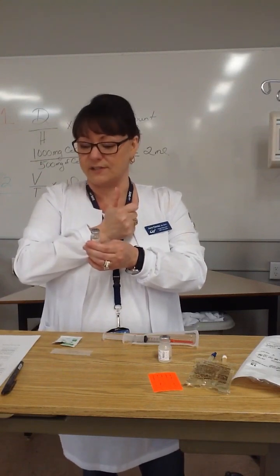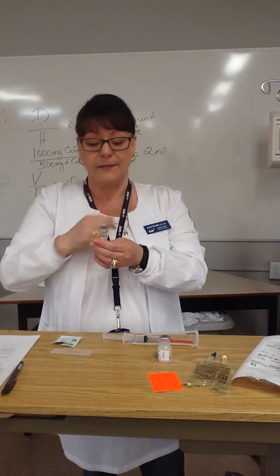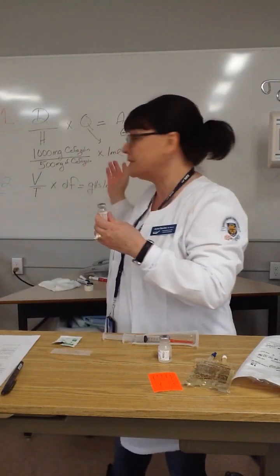While we're doing that, or after we finish that, somewhere in preparation time, we're going to do our second medication check. And that requires us actually looking at our vial, comparing it to our MAR, and applying those 10 rights. Do I have the right patient? Yes, I do. I went in and I identified my patient, and I'll do it again when I go back in to attach this medication in its secondary bag. Do I have the right dose? No, not yet, but I have the right concentration, and soon I'm going to draw up the right amount of medication, which is 2 mils, once I have this all dissolved, and so on and so forth. I'm going through those rights.